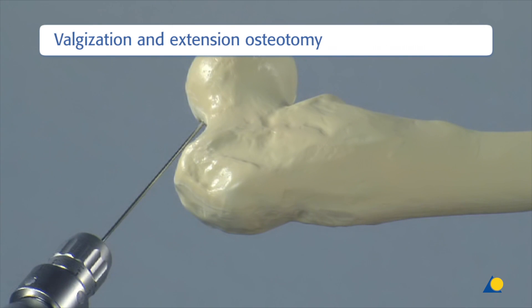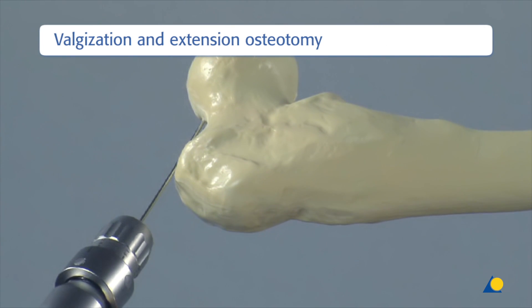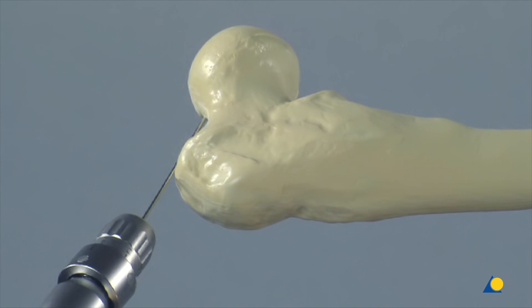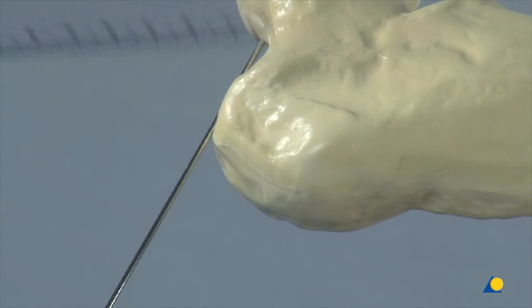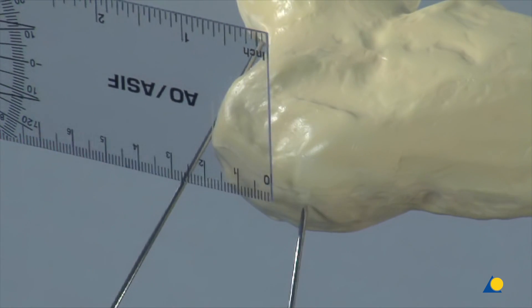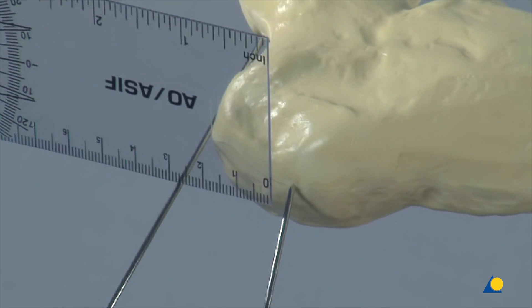A K-wire is inserted just below the tip of the greater trochanter aiming into the centre of the femoral head. In the axial view, the window for the seating chisel in the centre of the femoral neck is determined. The window is located approximately 3.5 centimetres below the tip of the greater trochanter.